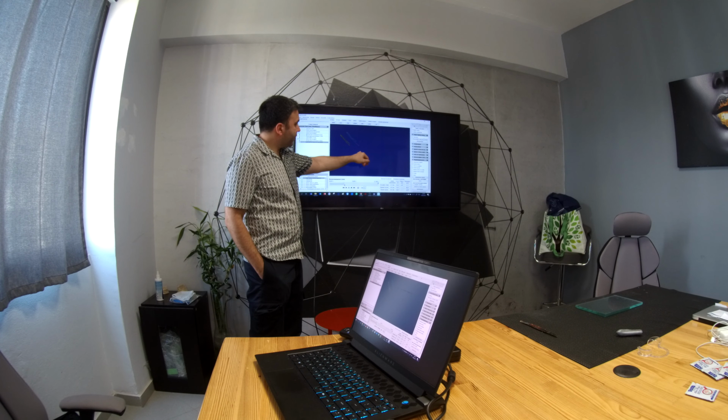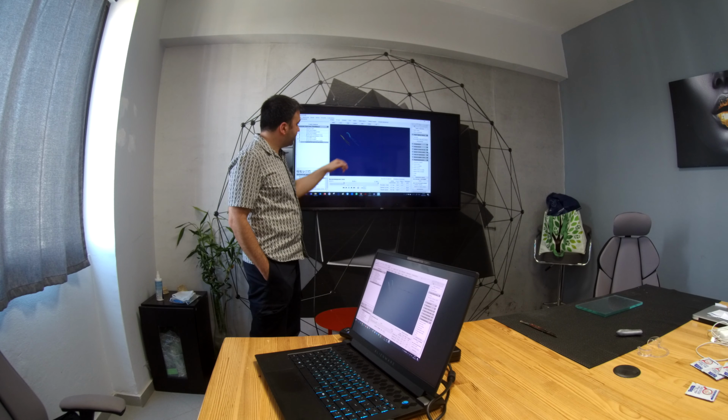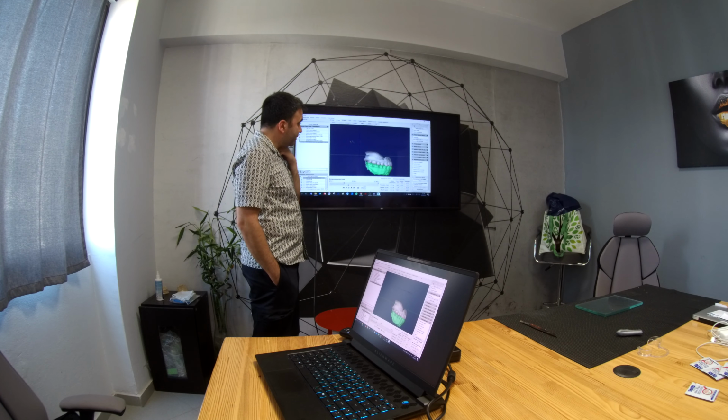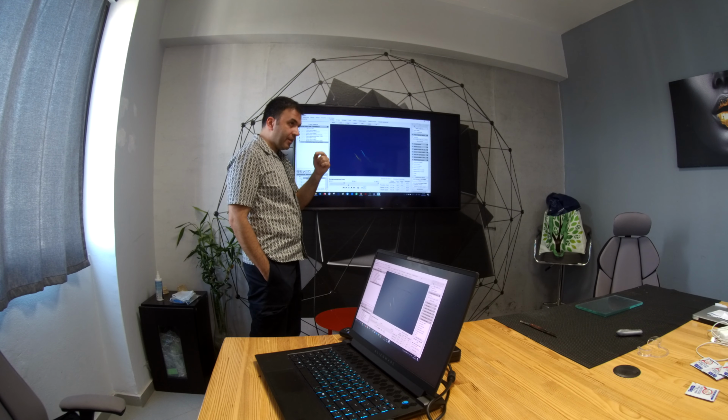See the second cross here. This is when the disc slips off. So he has to stop there, in this position. Okay. And this is the position of the lower jaw. After this position is the click. The second click. Yes, so before the second click. Okay.